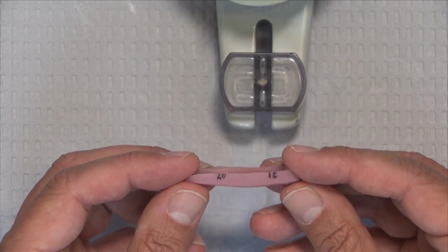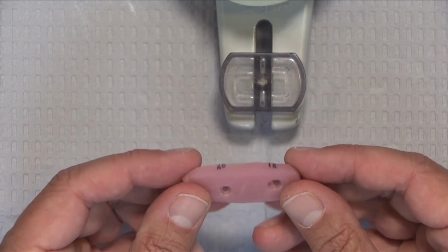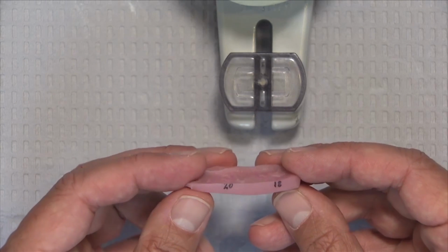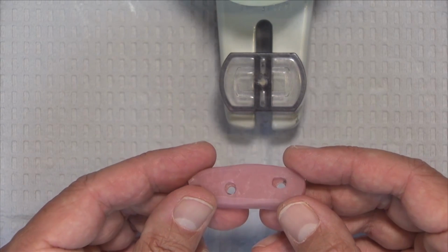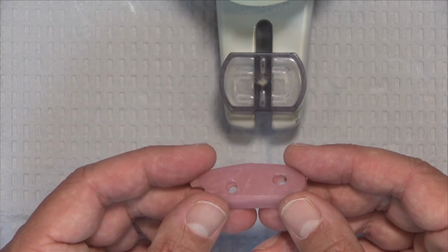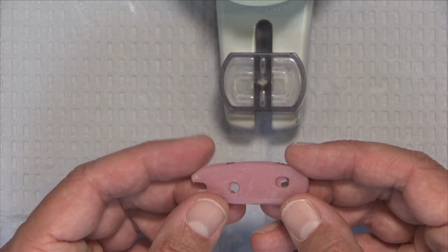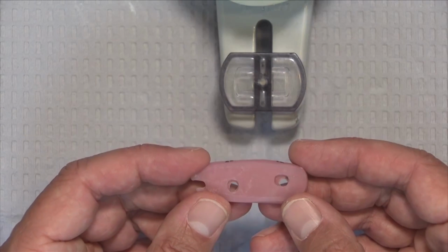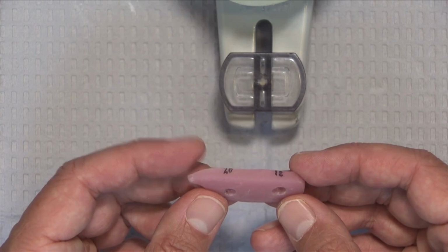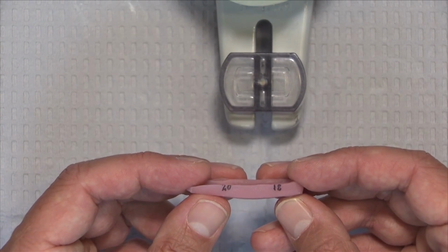This is the positioning and bite index as it comes back from the laboratory. It's easily marked so you can see where number 18 and number 20 are. And so we're going to use this to do two things. We're going to use this to position the custom abutments in the mouth and to verify and/or take a new bite registration in a really sturdy manner that's going to give a very accurate bite relationship to the laboratory so that we minimize our chances of having to make a lot of adjustments at the seat appointment.